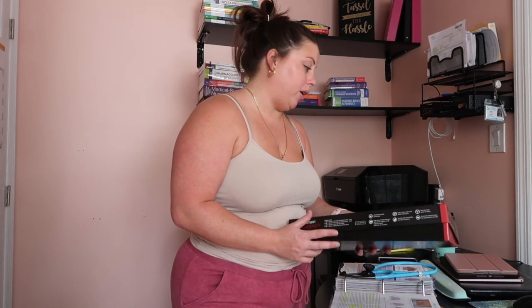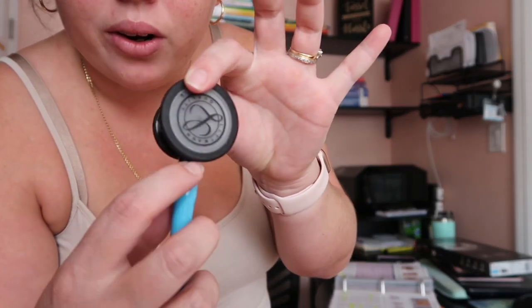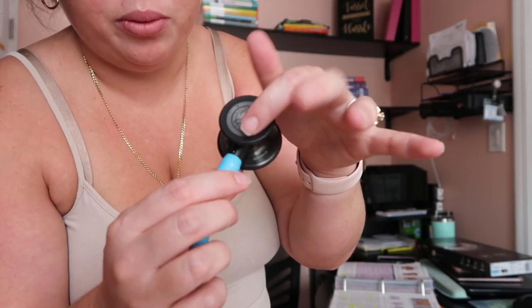Let's jump right into the parts of the stethoscope. You have the earpieces, the tubing which the sound goes through, your diaphragm, and your bell. The diaphragm is the bigger part and the bell is the smaller part. This one is an adult and pediatric stethoscope, so there's a little notch — you just turn it to switch between the two sides.